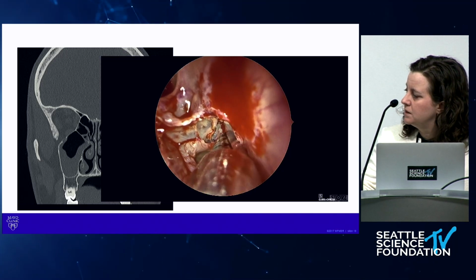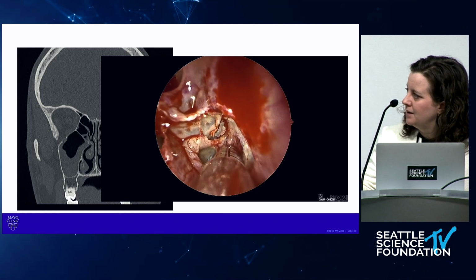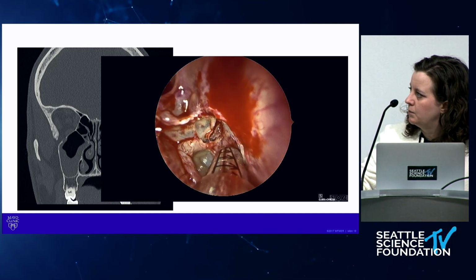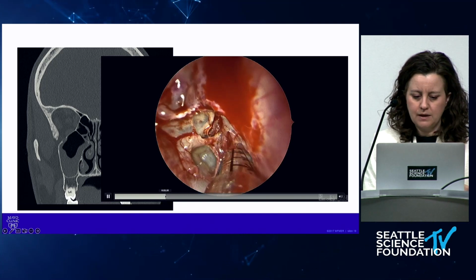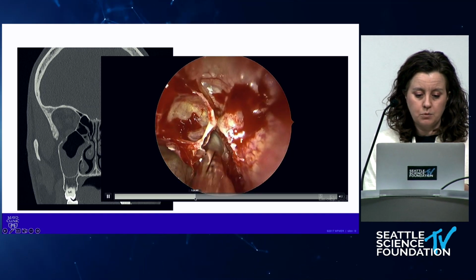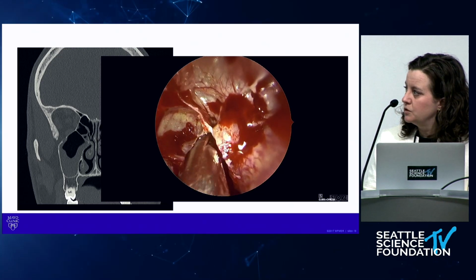Ideally, next we would see the superior turbinate. Since we already know our lamina, we can then come through medial and inferior, extend it towards the lamina, and then extend it upward. And the things you want to see, like I said, you want to see superior turbinate. You want to get into the posterior ethmoids. Now that we're through, we can start dissecting those posterior ethmoids.